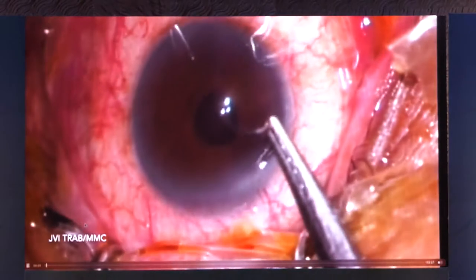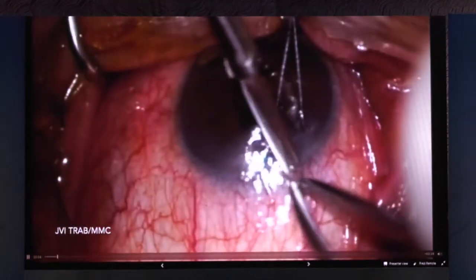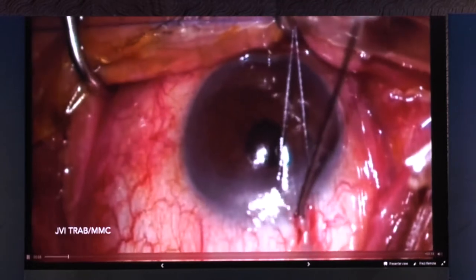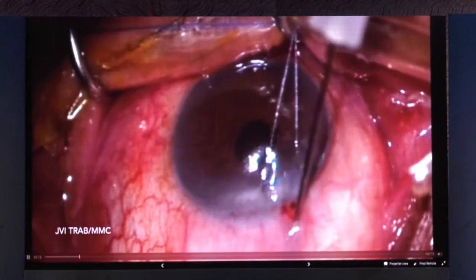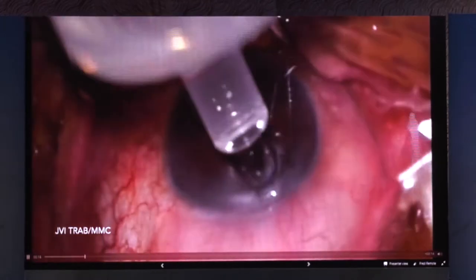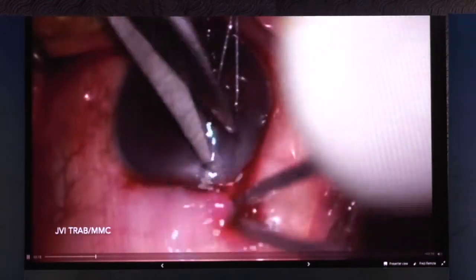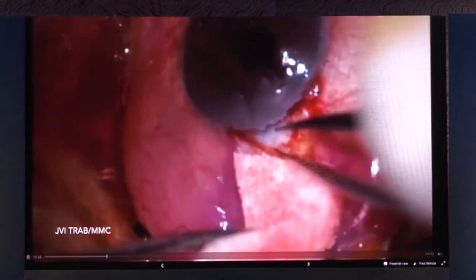This is how I do a trabeculectomy. I put a stay suture or a traction suture, and I aim for the supranasal quadrant. I make a small snip in the conjunctiva. I do my surgeries all under topical anesthesia. In the case of trabeculectomy, I inject subconjunctival lignocaine neat, and then I inject mitomycin C half strength. I wash it out. And then I create a conjunctival subtenon pocket, like so, fornix-based incision, of course.